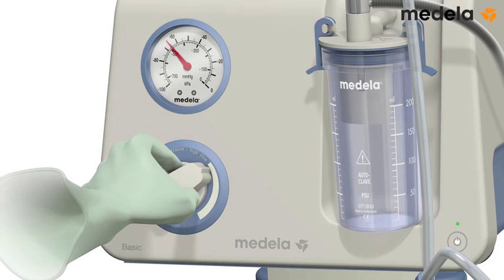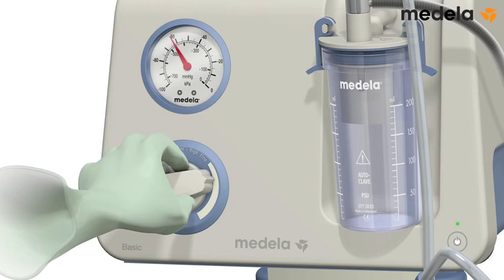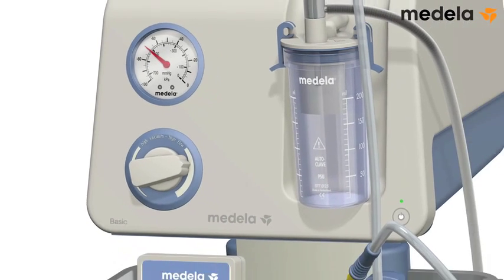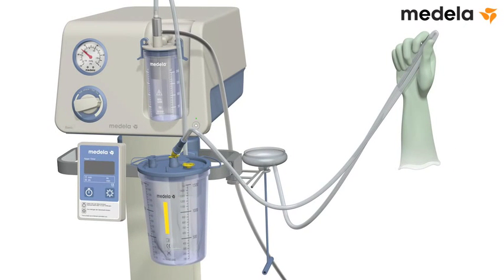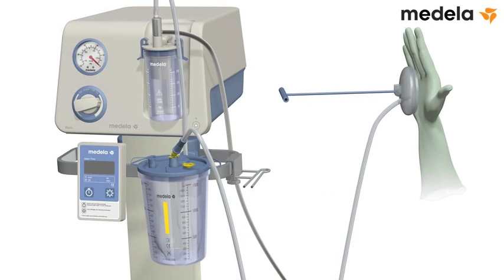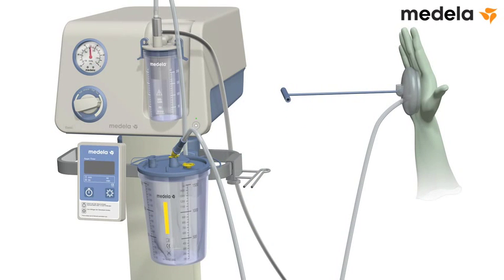The recommended vacuum level is between minus 60 and minus 80 kilopascal, equivalent to minus 450 and minus 600 millimeters of mercury. When the vacuum gauge shows that the vacuum is stable at the set level, release the tubing. Test the vacuum against your sterile gloved hand.